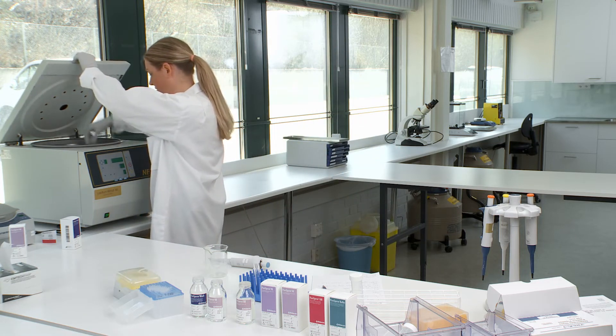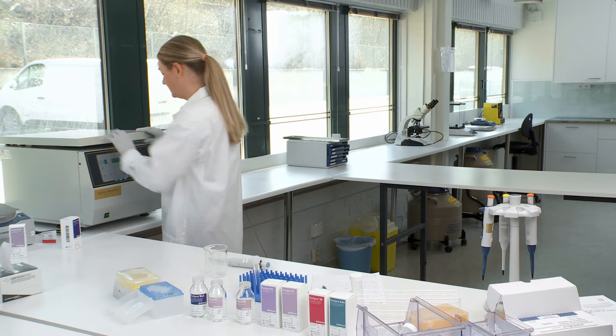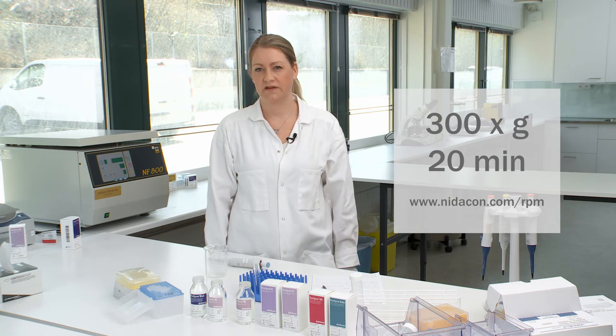Make sure you put another tube in the centrifuge to balance it with the same volume. The program should be set to 300 g for 20 minutes. There are instructions on our website on how to calculate the correct RPM for your specific centrifuge.